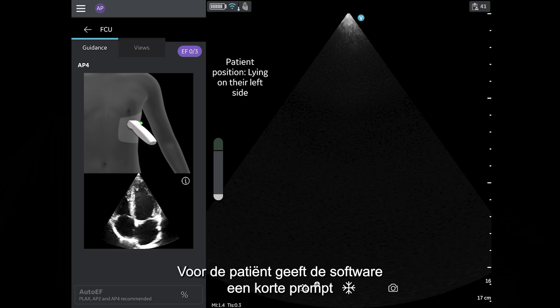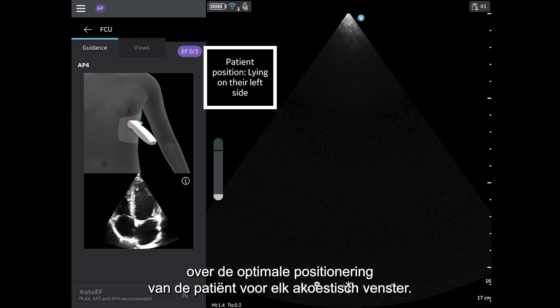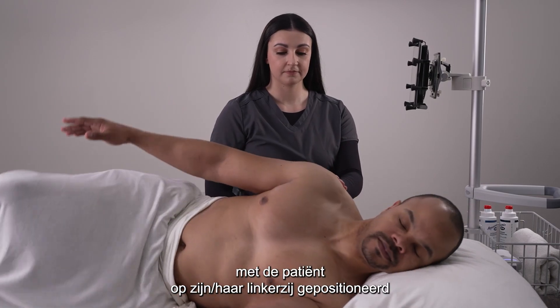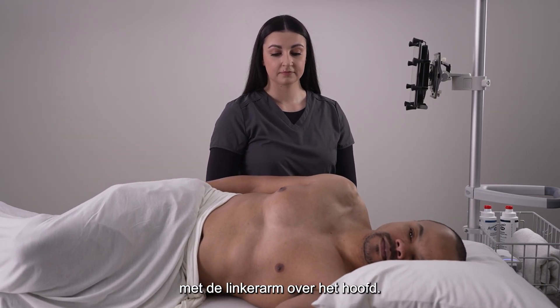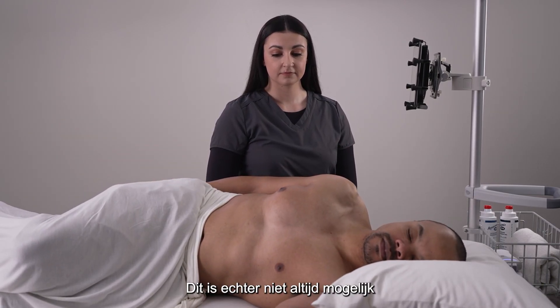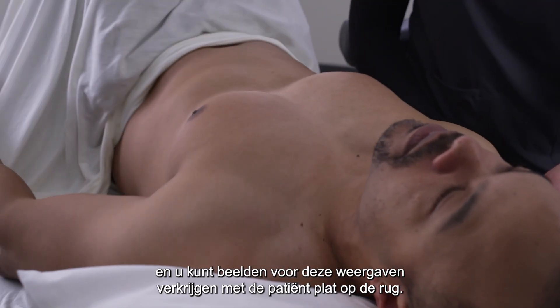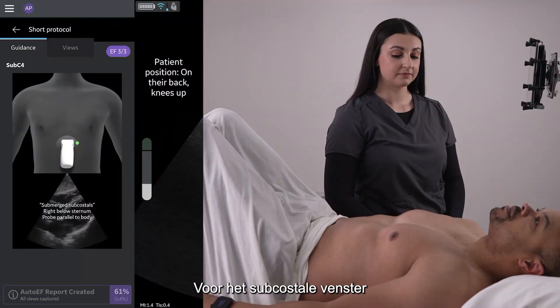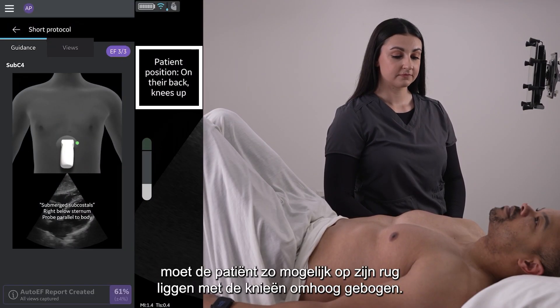For patient, the software will provide a brief prompt regarding optimal patient positioning for each acoustic window. It is best practice to scan parasternal and apical views with the patient positioned on their left side with their left arm over their head. However, this may not always be possible and images for these views can be acquired with the patient lying flat on their back. For the subcostal window, the patient should lie on their back with their knees bent up, if possible.